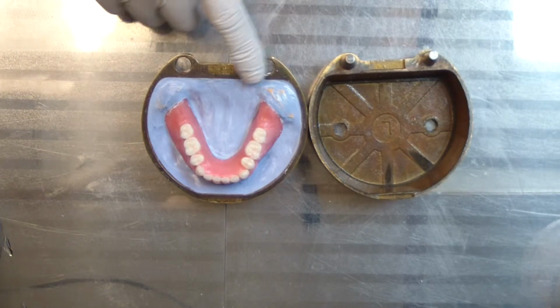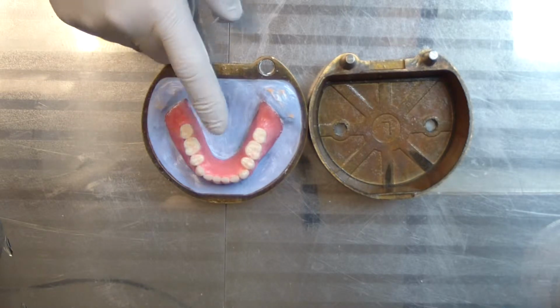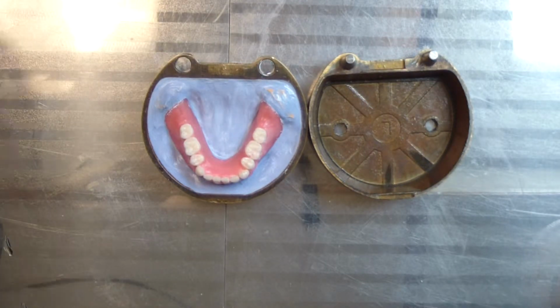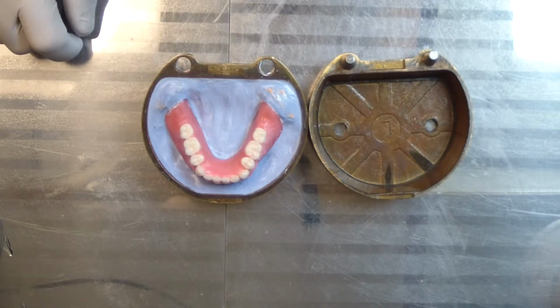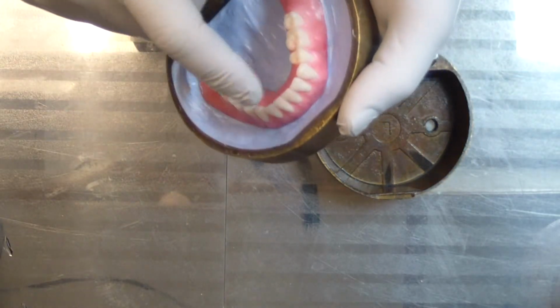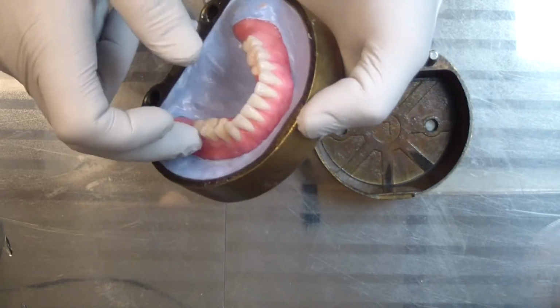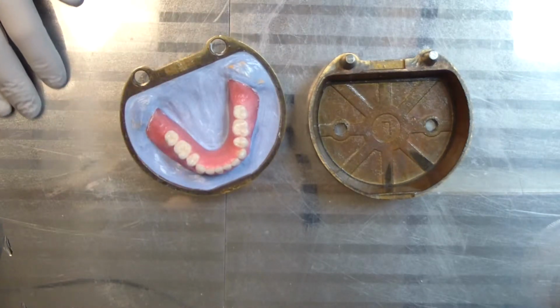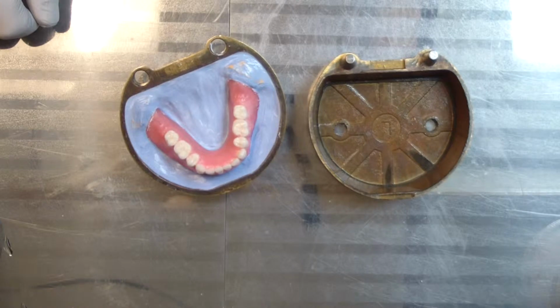So the first pour was done with flask stone, and so I have applied the separating fluid. I used the Ivoclar's cold sep. I did 2 coats of it. I made sure that there's no separator anywhere on the teeth, and you try to avoid putting any on the wax as well, because separator tends to interfere with the stone. It might create inconsistencies and stuff like that.